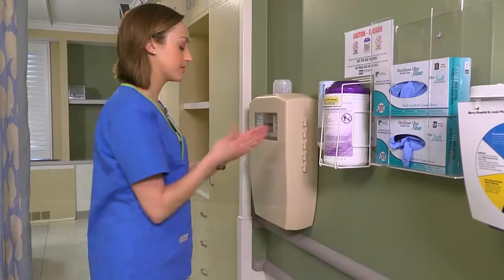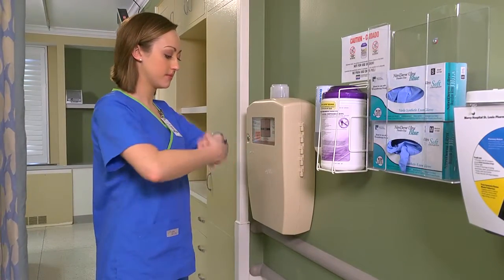Begin gastric occult blood testing by reviewing the patient's history for GI bleeding or other GI disorders, and for drugs that can cause mucosal bleeding in the GI tract. Perform hand hygiene.